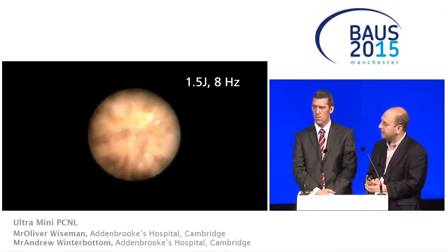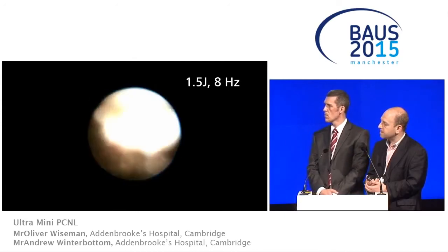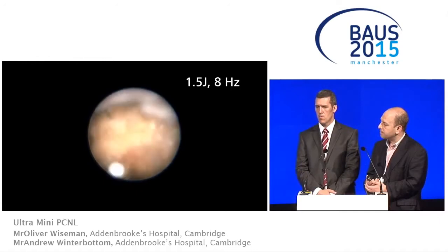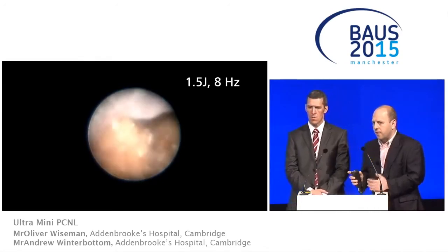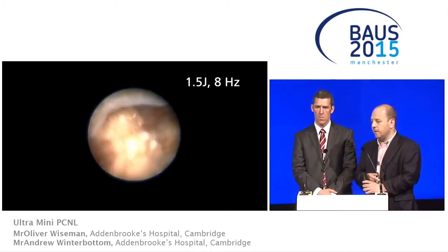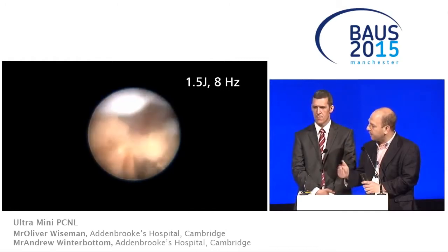A couple of questions have come through which follow on from what you've just said. What are the advantages and disadvantages of this over supine? And there's such a low transfusion rate anyway with a standard PCNL. Why use this mini kit? Whether you do this prone or supine is... standard, not supine. Oh, okay, sorry. So what are the advantages of this over standard with a low transfusion rate?